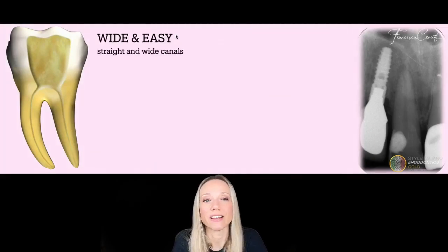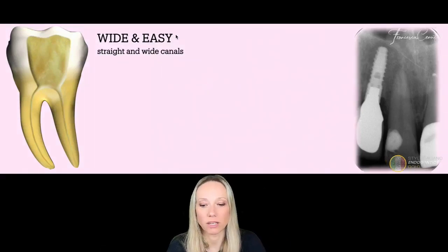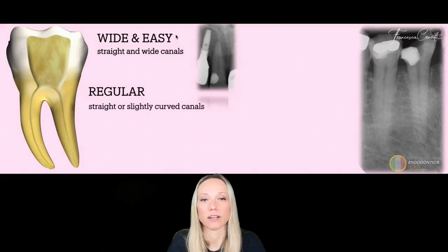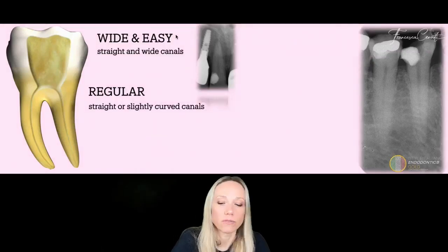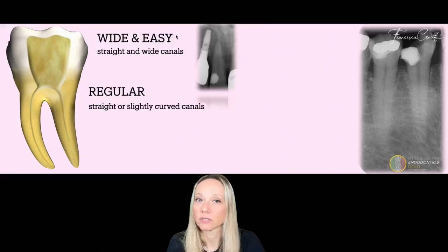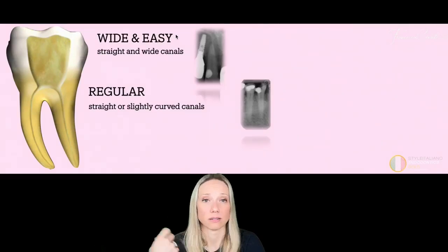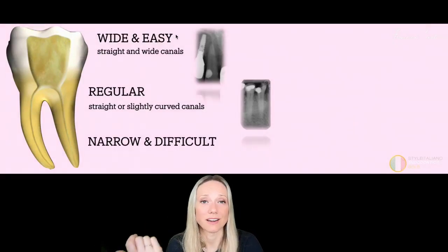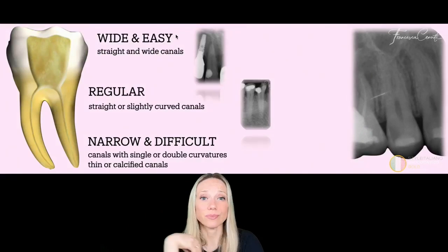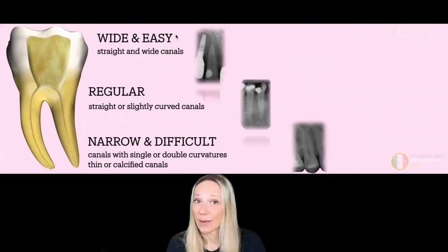In a wide and easy canal, which is straight, wide, where I have no difficulties given by the anatomy, I will use one protocol, which is different from the protocol that I'm going to use in a regular canal. That means that it's maybe slightly curved, but a little bit smaller than the one that we saw before. So maybe I could encounter some difficulty here. Okay, I'm going to have another kind of behavior in canals that are narrow, difficult, aberrant anatomies, etc. Because in this case, I will have to pay even more attention to what I'm doing. And so, let's see them one by one.